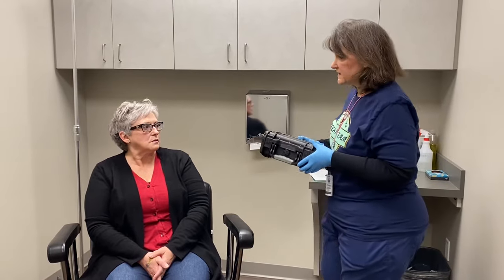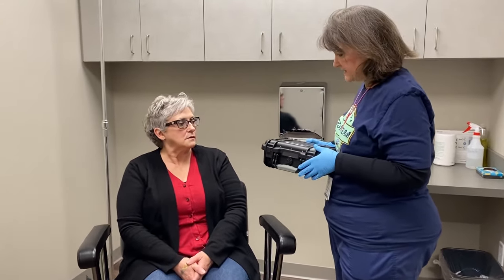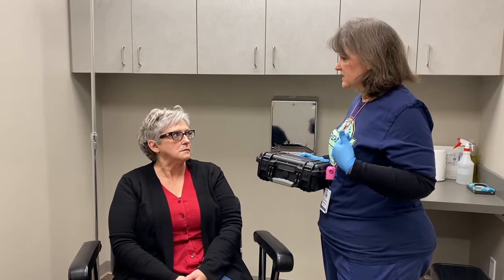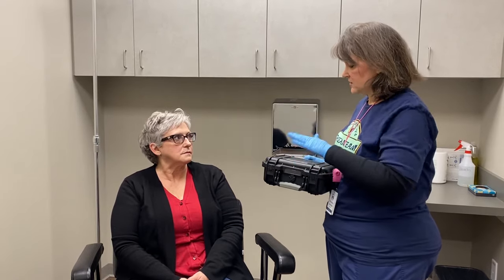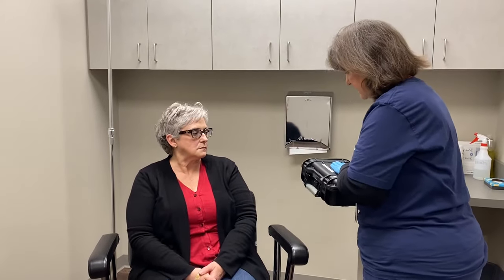Have you ever done anything like this before? No, I have not. I'm going to go over everything with you step by step. For tonight, you'll need to wear a nightgown, pajamas, a t-shirt, or something so that you can place the device on top of it and it's not against your skin. Everything you need is in the box.